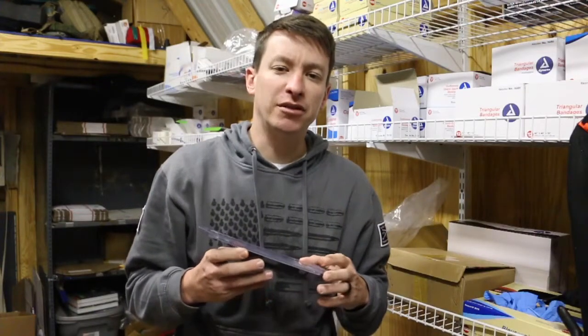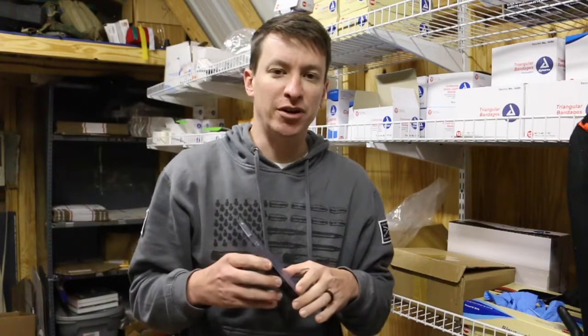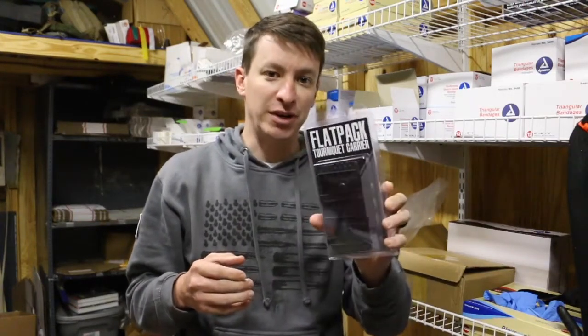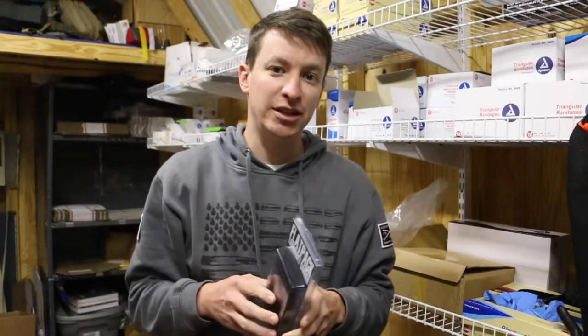Hey, welcome to another video from Medical Gear Outfitters. Just want to give you a heads up that we are now carrying the Filster Flat Pack Tourniquet Carrier. This is a great way to carry the Soft T Tourniquet and the Cat Tourniquet.